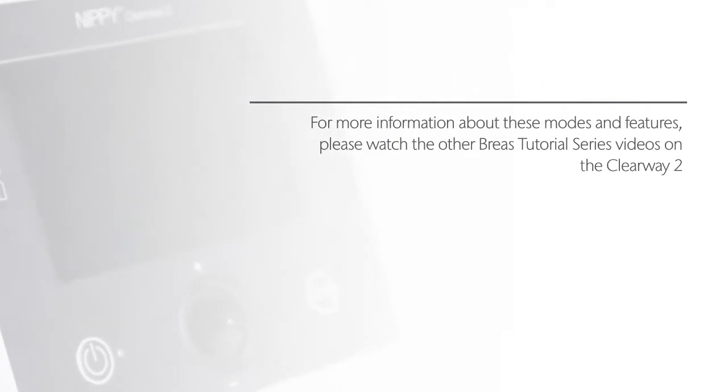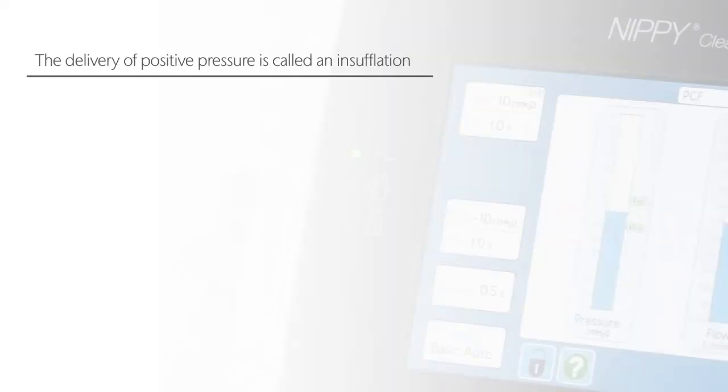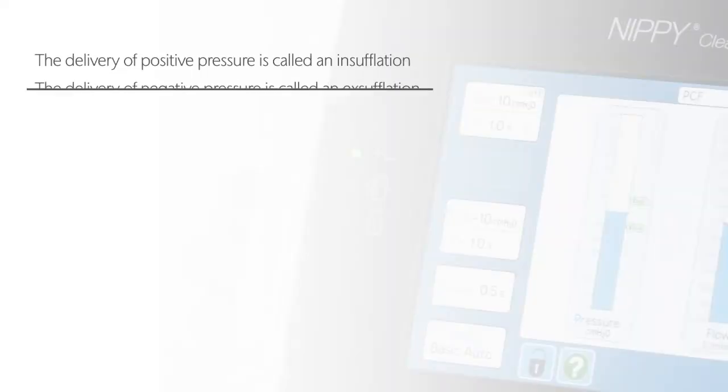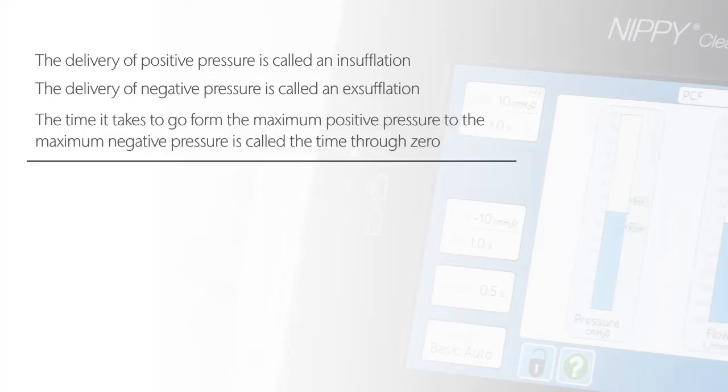The Clearway 2 uses positive pressure to inflate the lungs then rapidly shifts to negative pressure in order to create a high flow of air exiting the lungs to simulate a cough and help to clear secretions from the airways. The delivery of positive pressure is called an insufflation. The delivery of negative pressure is called an exsufflation. The time it takes to go from the maximum positive pressure to the maximum negative pressure is called the time through zero.